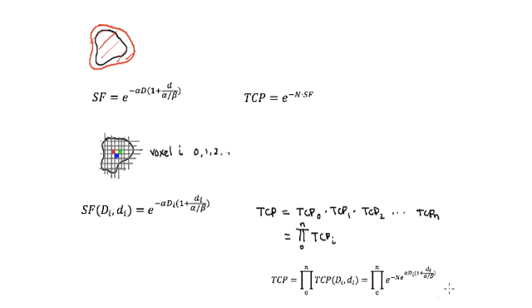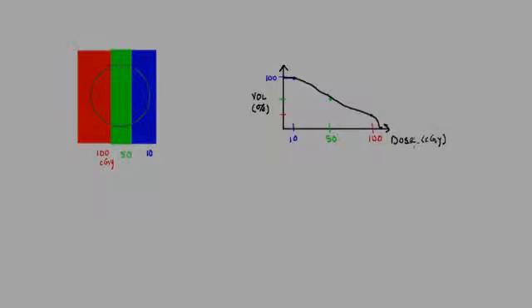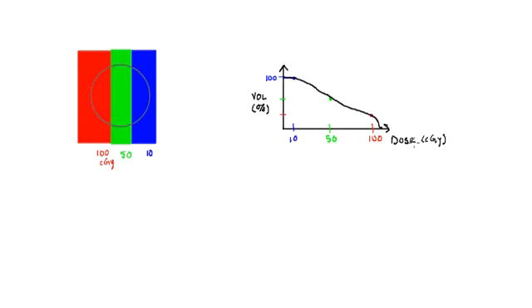So this formula, I admit, looks complicated, but the basics are pretty simple. In the end, you can take this relatively complex dose distribution and the corresponding DVH, and you can turn it into a single number for tumor control probability. So that has great utility, as you can imagine. It's used in many studies. It can also be used during optimization of IMRT and VMAT plans, and we'll talk about optimization in a future video, but it can be used to drive that optimization.